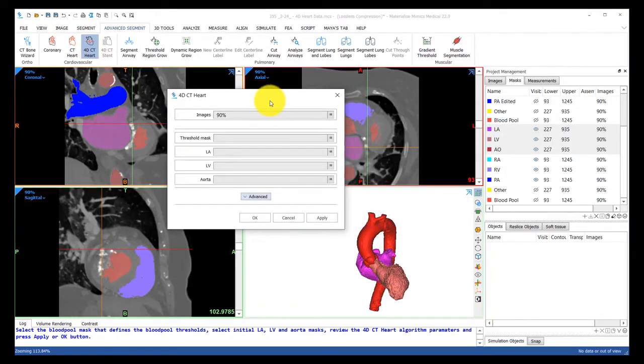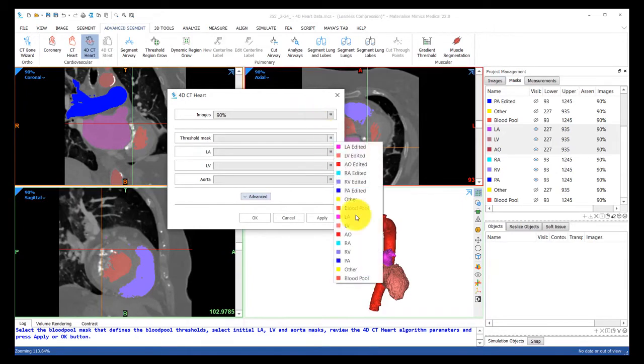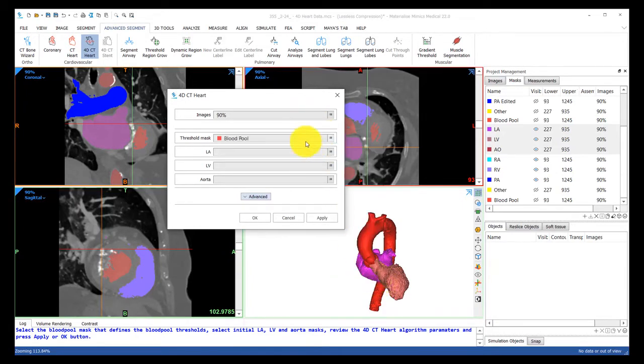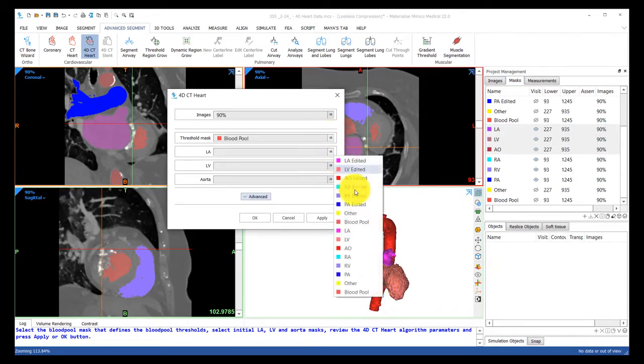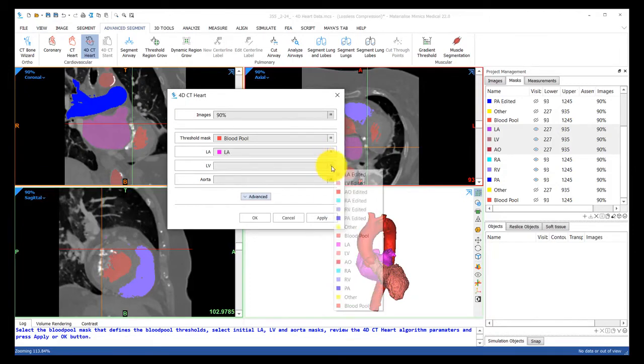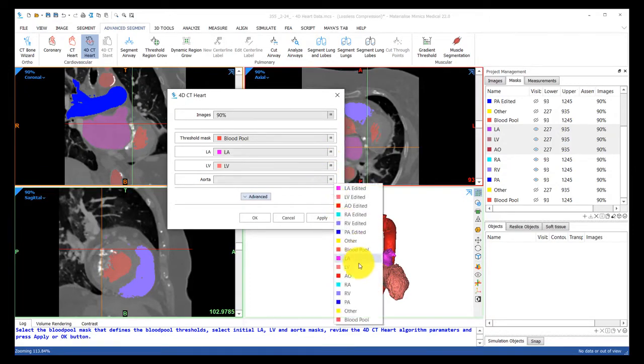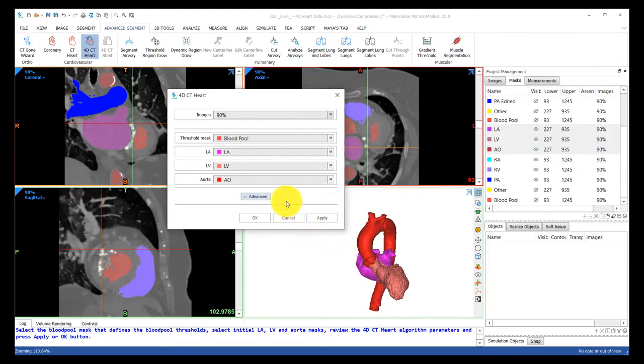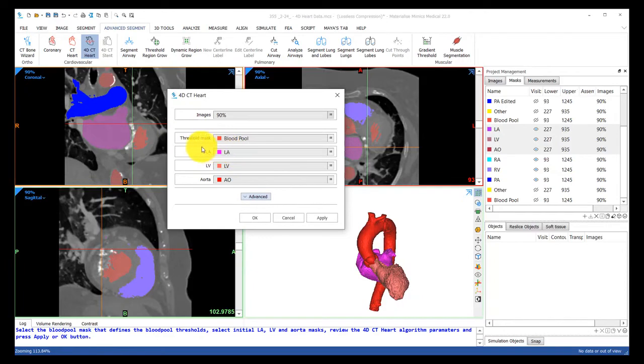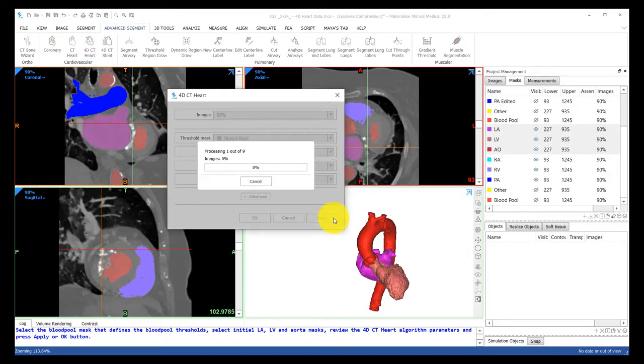It's asking us to identify the masks it should use as reference to segment the rest of the scans. So we'll have the entire blood pool as our threshold mask, the LA for LA, LV for LV, and AO for aorta, and hit apply.